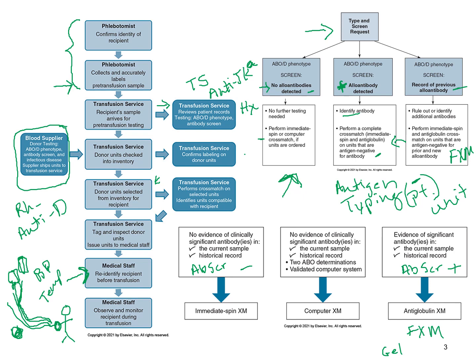And then the computer system has to go through validation procedures to ensure that it will not allow an incompatible product to be assigned. And you will have to maintain proof at your facility that those validations were done on that computer system, to ensure that an incompatible product is not issued in error.